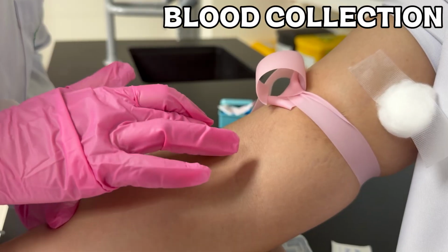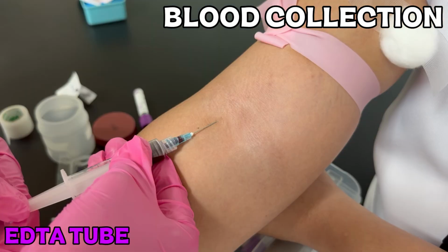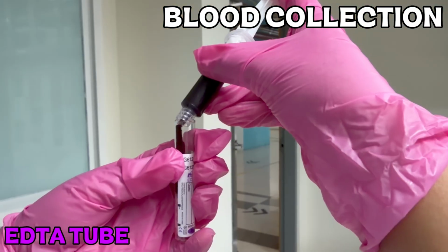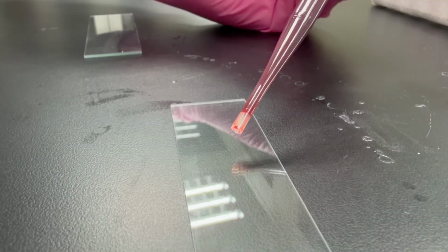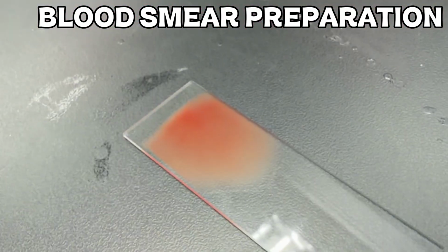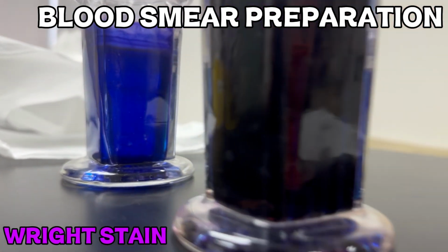First, a blood sample is collected from the patient through venipuncture and is placed in an EDTA tube to prevent clotting. The blood sample contains all the blood cells, including the platelets that will be examined. Next, a thin peripheral blood smear is prepared on a clean glass slide and is stained using Wright stain to allow the blood cells and platelets to be seen clearly under the microscope.